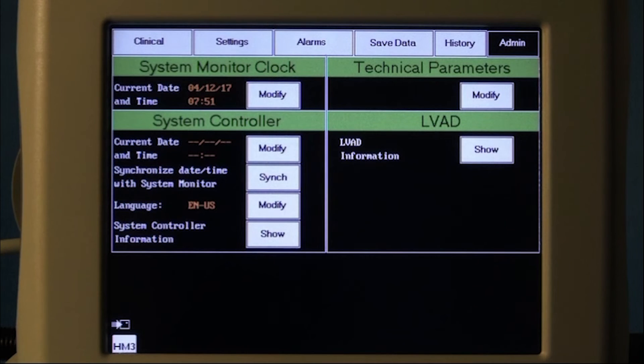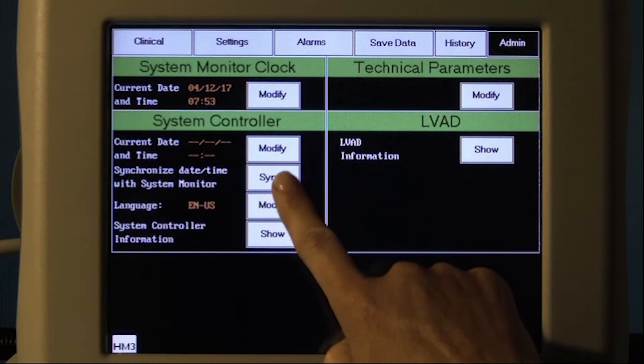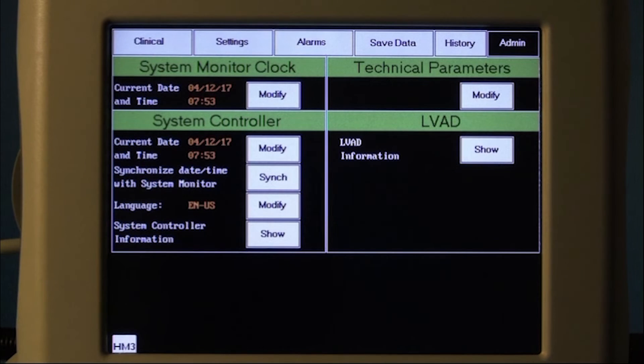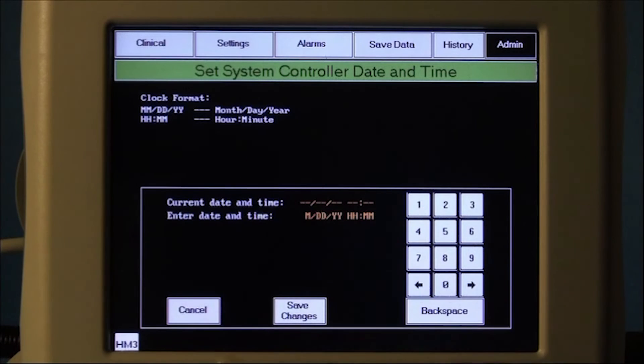Go to the admin screen and verify the date and time are correct on the system monitor. Then set the date and time in the system controller by either pressing the sync button to synchronize it to the system monitor date and time, or the modify button to enter the date and time.